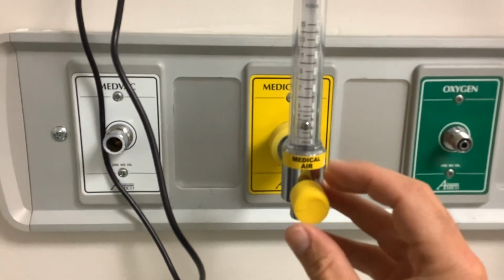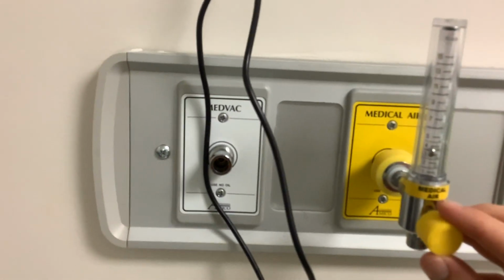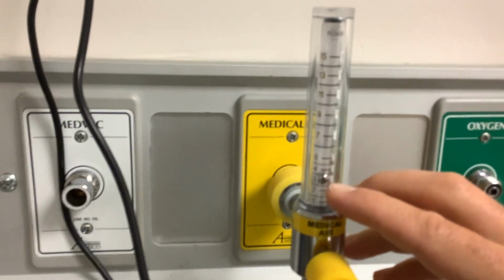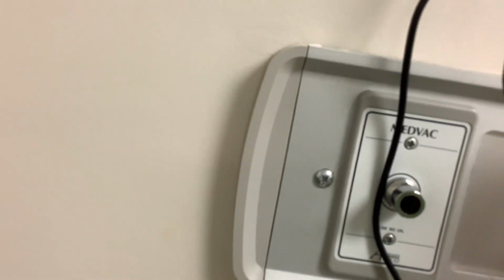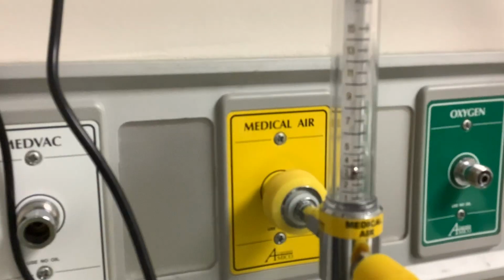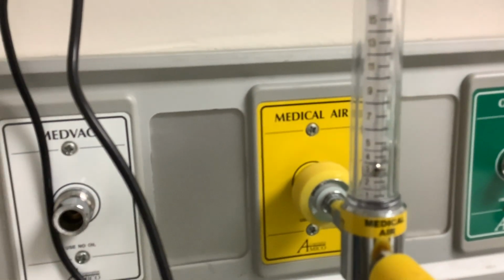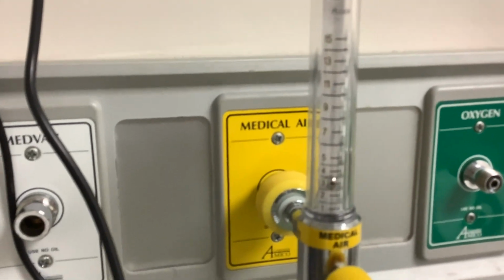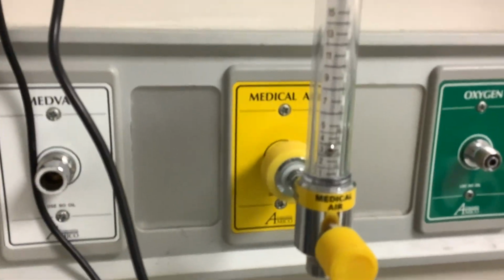But we're going to want to make sure that if we were going to set this to say 3 liters per minute, you want to make sure that that ball is bisected by the line that runs by 3 liters. So I would need to look at that head on and make sure that that ball is bisected by that line at 3 liters. If the ball is above the line for 3 liters, you're given more than 3 liters per minute of flow. If the ball is less than that, then you're given less than 3 liters per minute of flow.